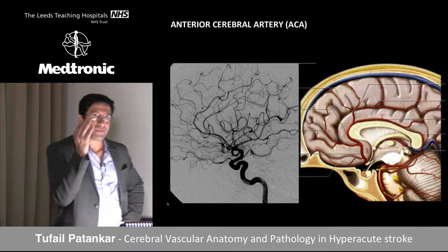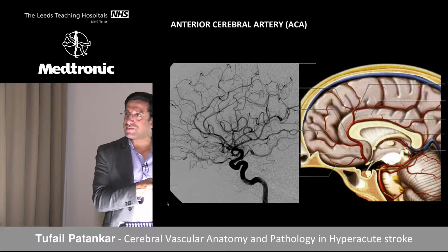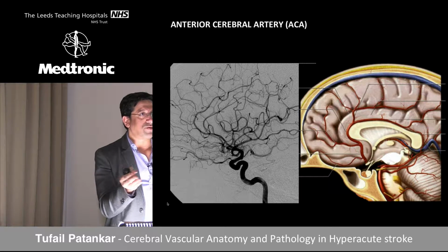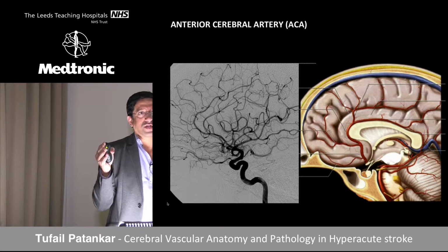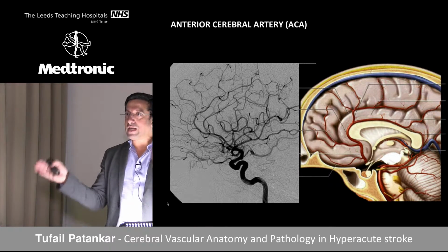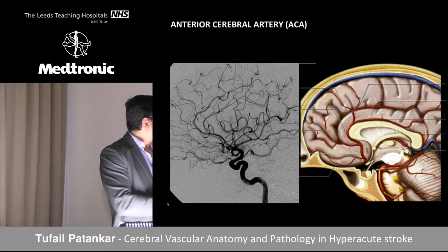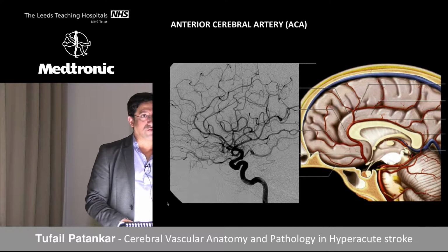Yeah. So one time, in the beginning when we started doing strokes, it was pretty different to us than when we were doing aneurysms. We used to do an anterior MCA, and then if it's an M2, on a frontal view, you just can't see it. I think, I can't see a stroke. And then when you do on a lateral view, you know that there is an absence of filling there. You know there is a vessel which is missing, and you have to find it.